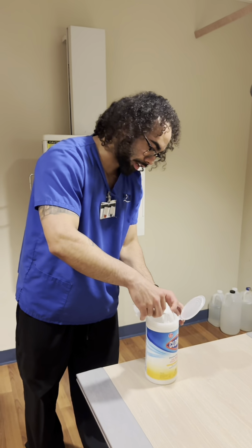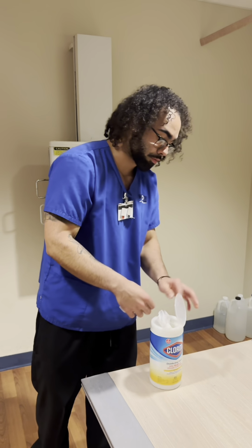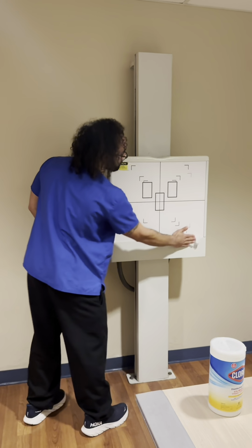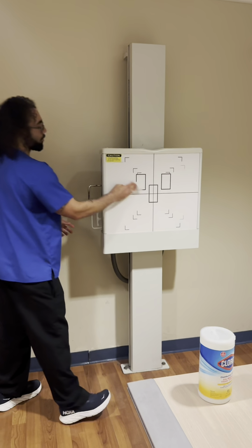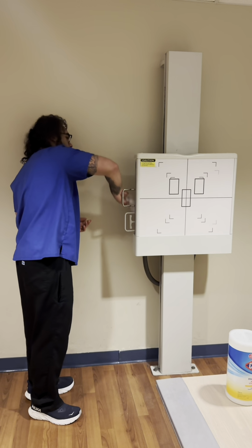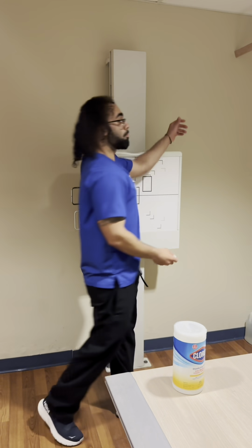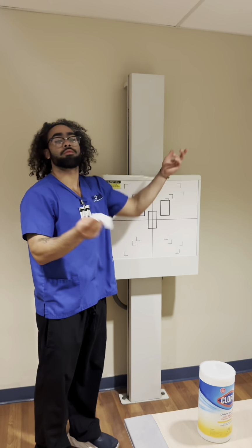And of course, if you are x-raying a suspected TB patient, you're going to want to wipe down anything that they touched, including the board here. And then don't forget the back sides as well. And then if you have a bar to reach up for your lateral chest, make sure you wipe that off too.